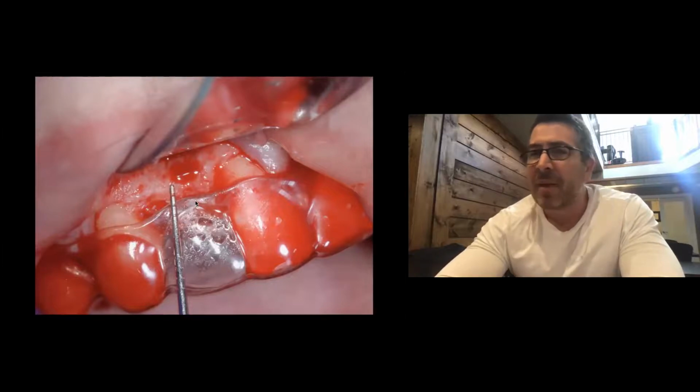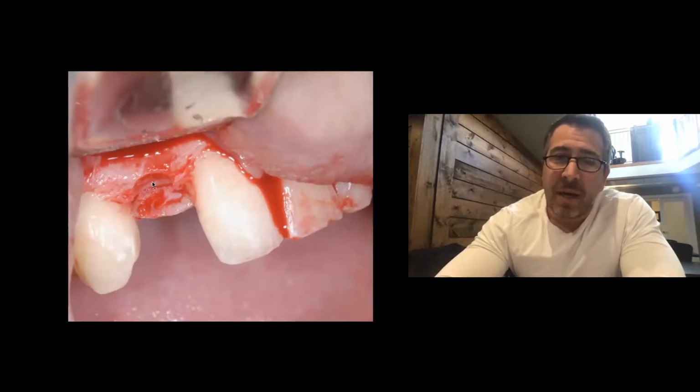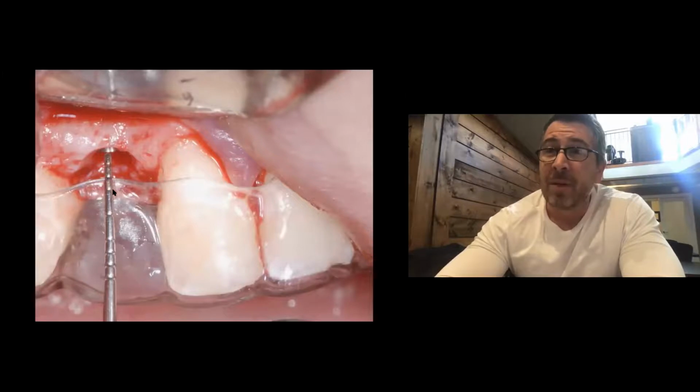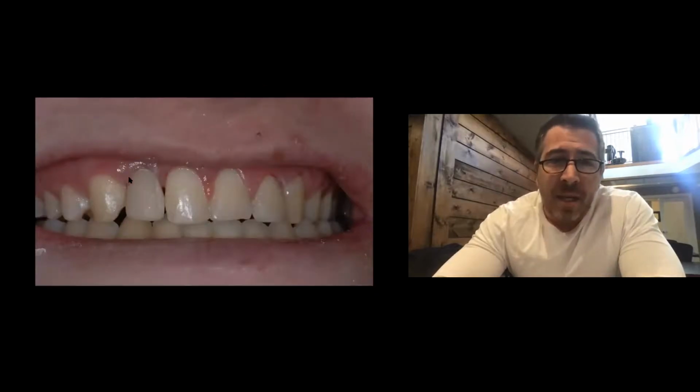If I place the implant on that patient today, the crown would be very stubby. So we do a little bit of reduction. Now I've got from the head of the implant to the zenith, my 3 millimeters that I need for my spacing. So very important, bank that one for your congenitally missing lateral cases. That ends up with a zenith in a nicer position.